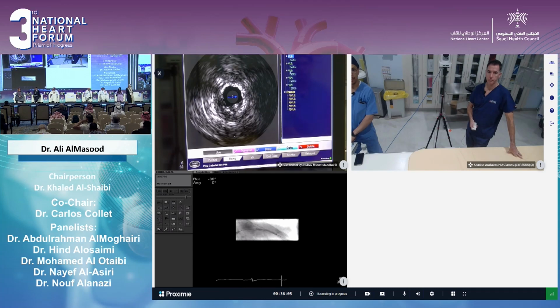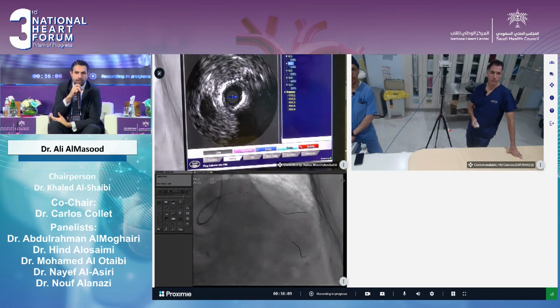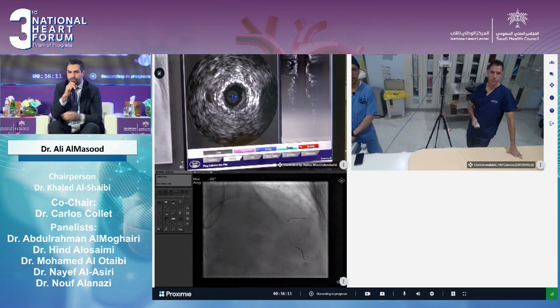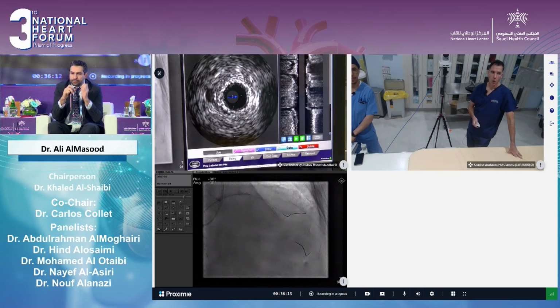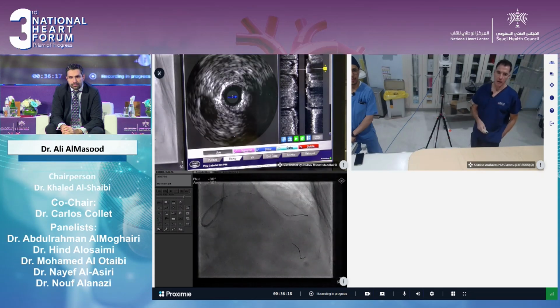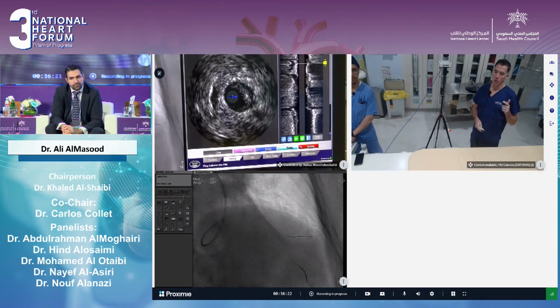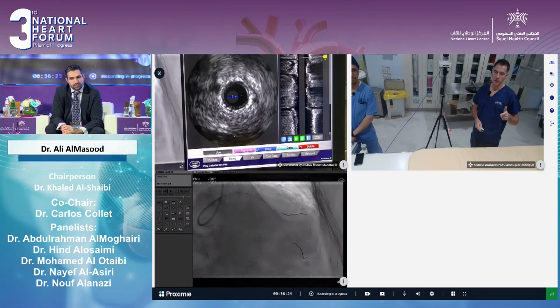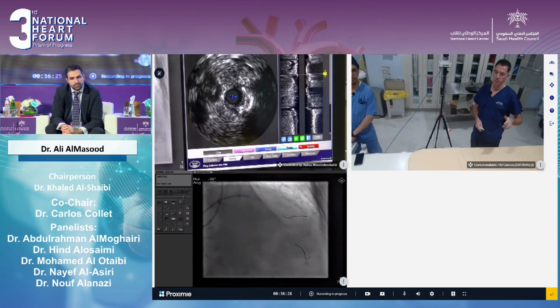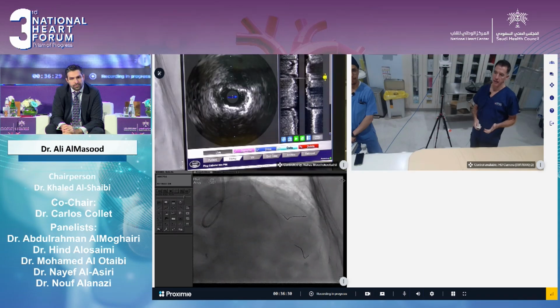Colin, if you want to show us perhaps the angiograms after you place the first stent and which technique. It looks like a provisional case, but what have you opted for at the end? Well, I think the point is we'll show you the fracture on the IVUS after the NC balloon. We felt that this was extensive atheroma all the way down to the distal LAD, back to the ostium in the left main. We did pivot from a DCB strategy. We talked about that offline.